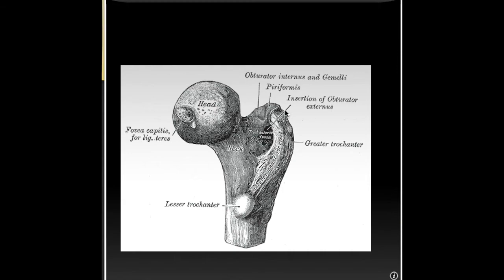Obviously, for a lot of these lesions, the margins are going to be less well defined, and we're not necessarily going to have an area of sclerosis, meaning bone reacting around that area. The reason that doesn't happen is because the growth is a little bit faster, and bone in general tends to, like any other part of the body, react to injury or inflammation.